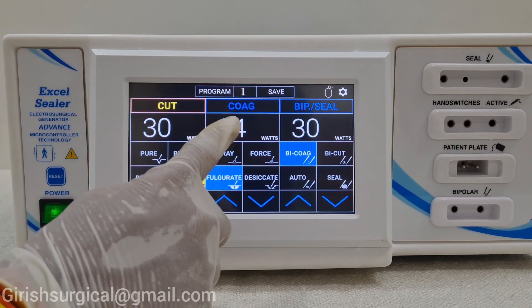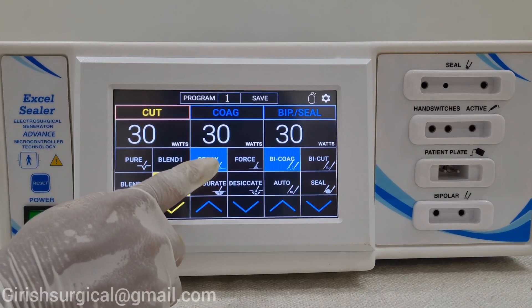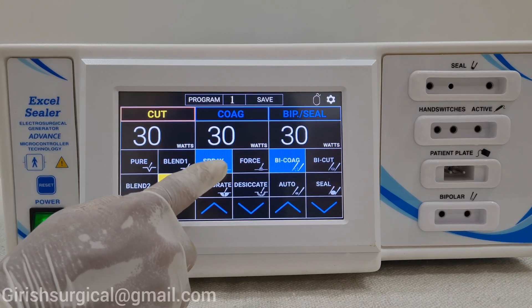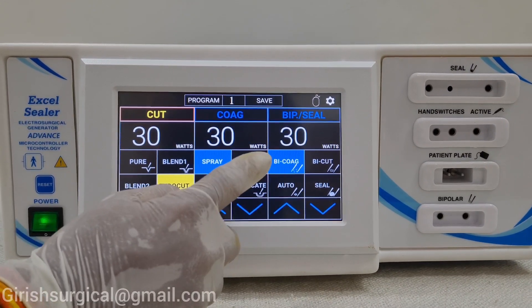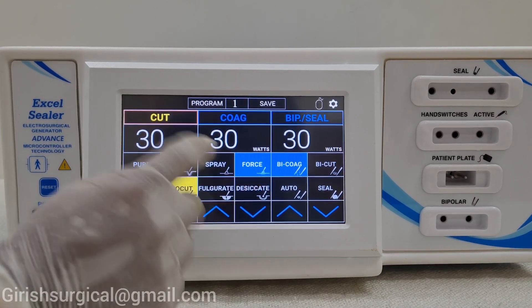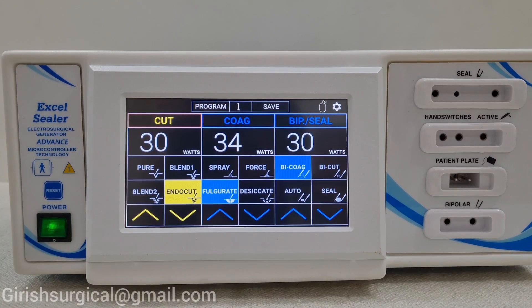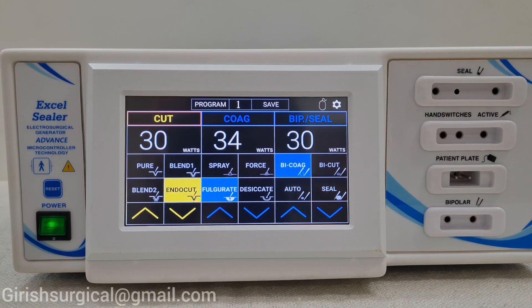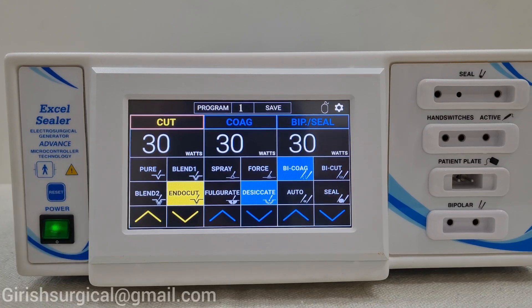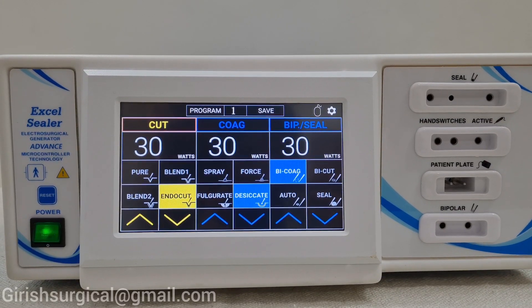Now we will see the coag column. The first feature is spray mode — in this the coagulation will be done in spray mode, which you can use for tumors, and the ball point electrode is used. In force mode, you can use the normal flat cutting electrode also, but the coagulation will be 100% coagulation. Fulguration will give you only the fulguration mode, which is comparable to spray. And this is the desiccate mode — you can use this for neurosurgery, spine surgery, or any point coagulation.